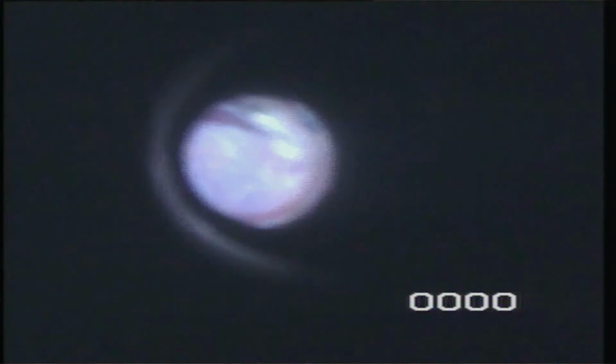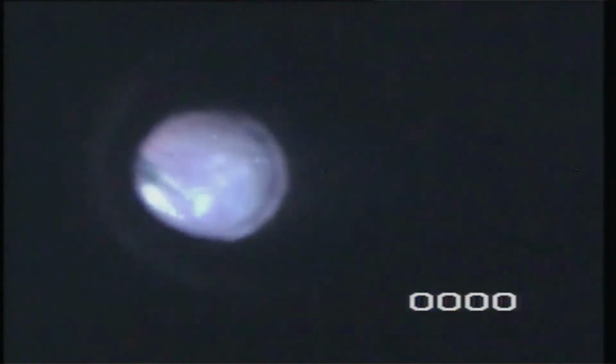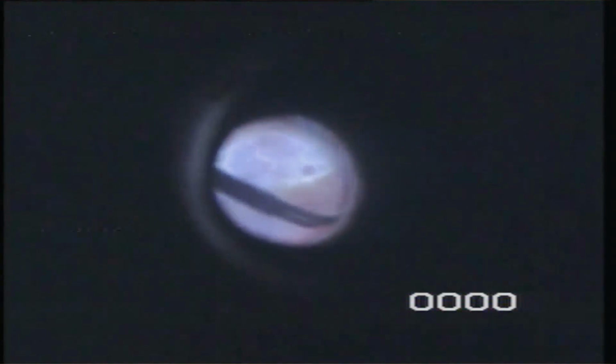And if there is any residual tissue left over the disc and it is not very adherent, it's better to get that off, as is being done here. Then you endodiathermize the break. The point about removing all traction around the break, which we were discussing, is very important, so as not to shift to another area if we develop an iatrogenic break in the area of dissection, because that can cause a combined or a rhegmatogenous detachment to obscure the rest of the surgery.